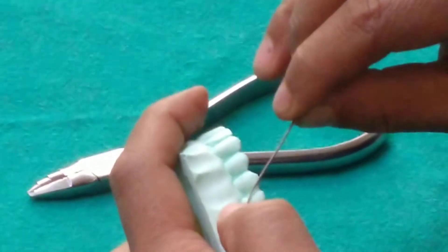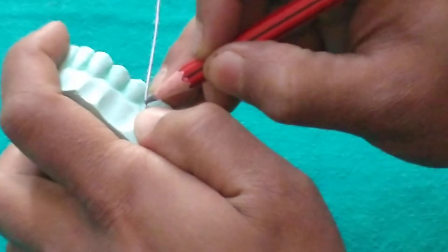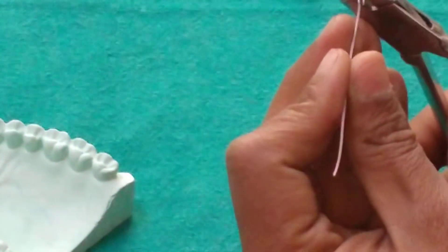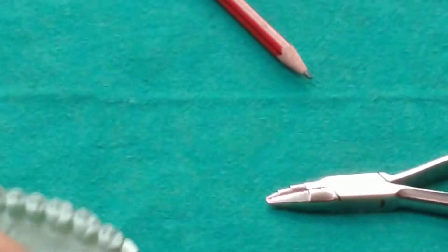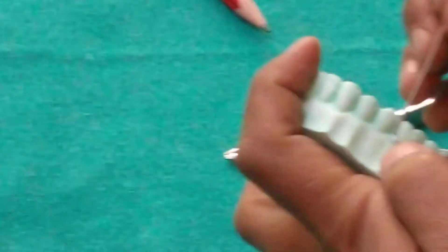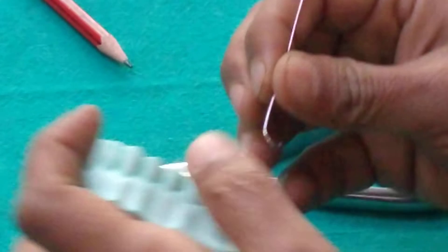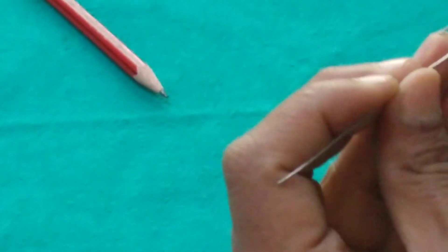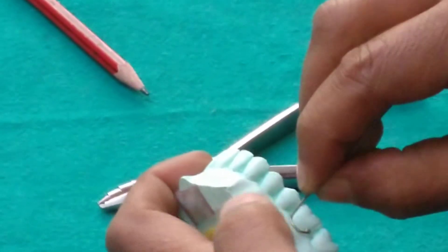The wire should engage the buccal cervical undercut. We are marking the wire so that a retentive bend can be given to the mesial proximal undercut. Adapting the wire to be moved through the mesial occlusal embrasure.